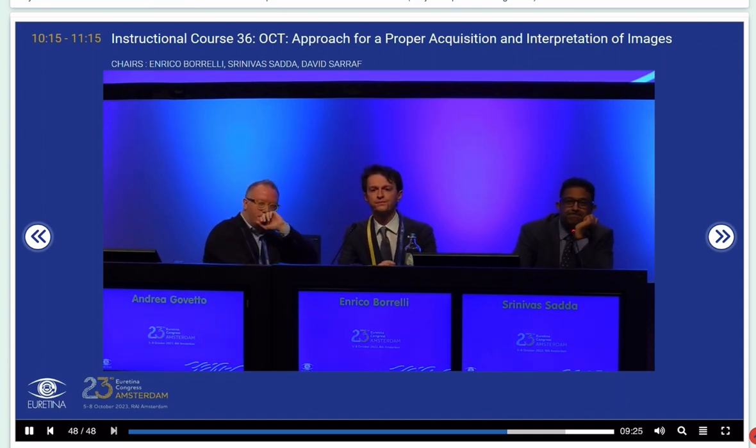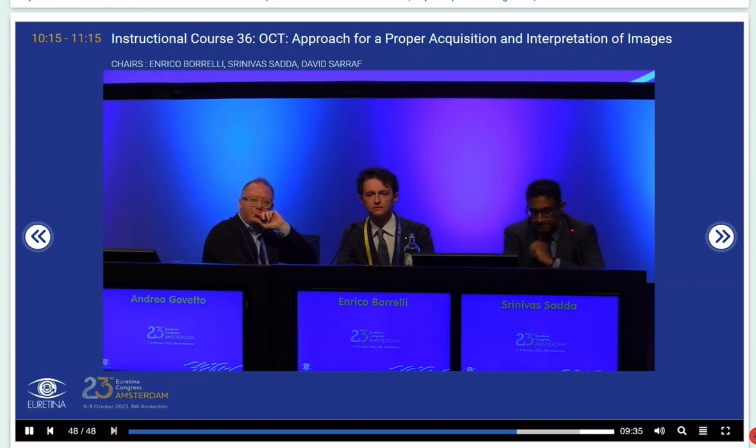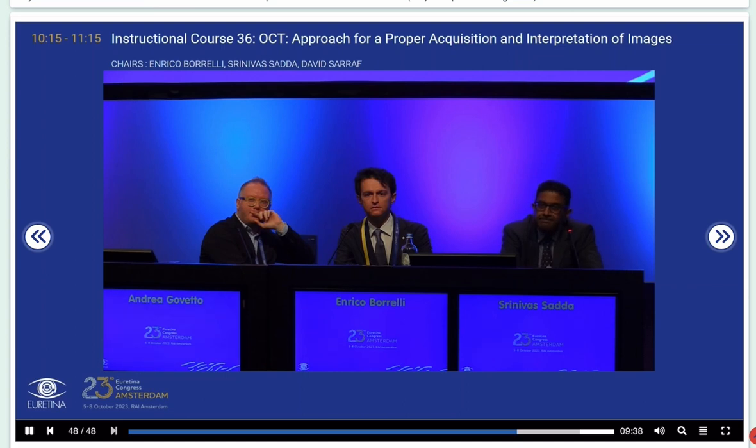It's on. Hi, this is Pamal Ashwin from the United Kingdom. Thanks for a nice talk about biomarkers. My question was about intraretinal cysts. And why is that terminology not being used very often? Has it become obsolete, or has it become merged with intraretinal fluid? Because we used to use the term intraretinal cysts for chronic cystic spaces, where no matter what you do, those spaces remain, and not to confuse them with the presence of intraretinal fluid. So that was one question.